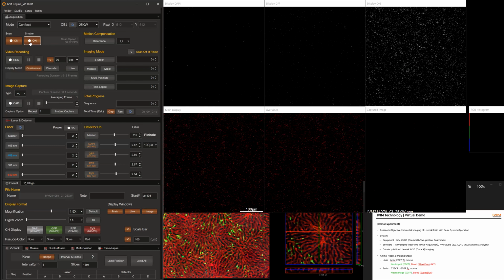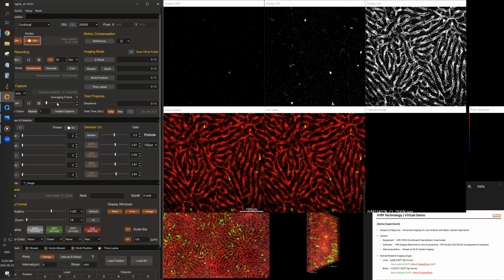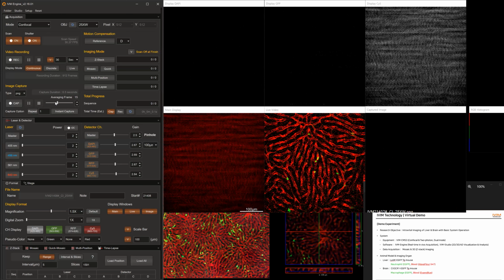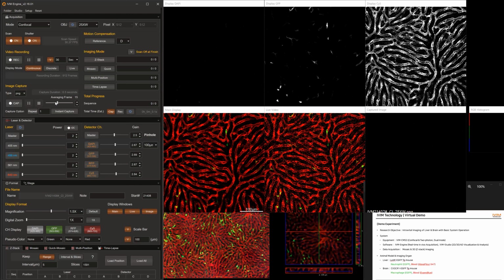It is totally feasible to see such a beautiful morphology of blood vessels in the digestive organ. Users can maneuver the jog dial, which lets us search for and navigate to the best field of view on this target organ. Those large branches of the portal veins with clear sinusoidal structure, along with the small arteries, seem to be a good spot to mark and to take the signals from.